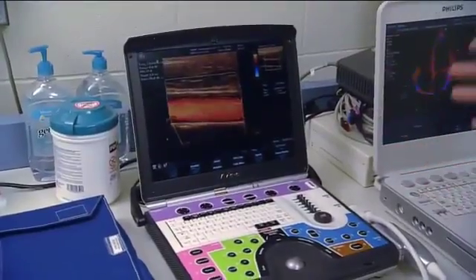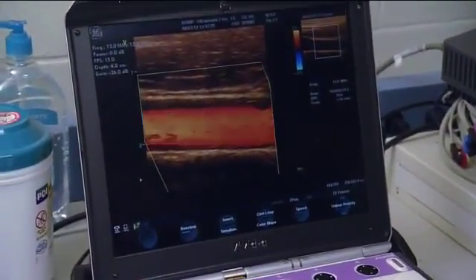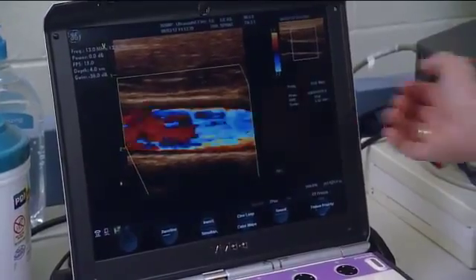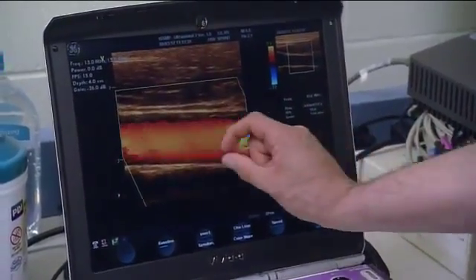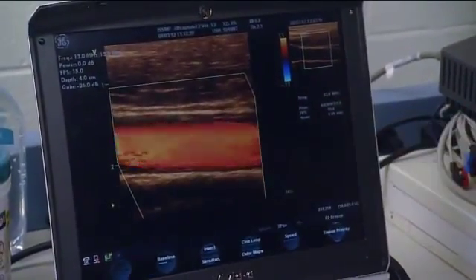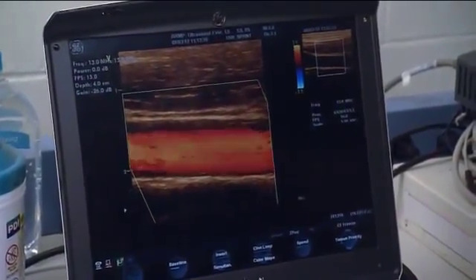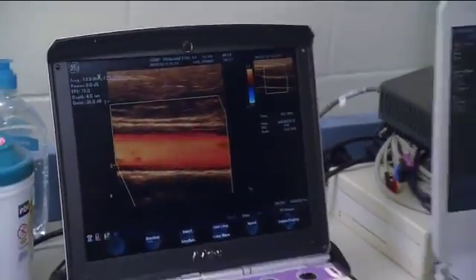That's Doppler. So if you think about the radars you've seen when we're looking at weather and they're showing how the winds and the rains are moving, and it's Doppler color, this is that same concept. It shows the colors moving, so this represents blood flow. So we measure that, and we measure the diameter of the vessel, and we can actually measure the thickness of the blood vessel. And on the ground, that thickness has been shown to relate to risk of atherosclerosis. So that's really what we're trying to get at. Is spaceflight at all changing the risk of getting atherosclerosis down the road for our astronauts?